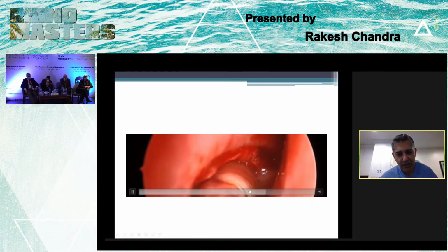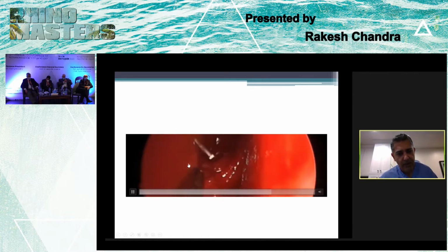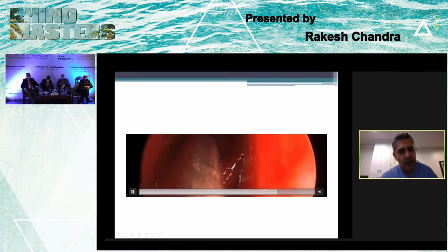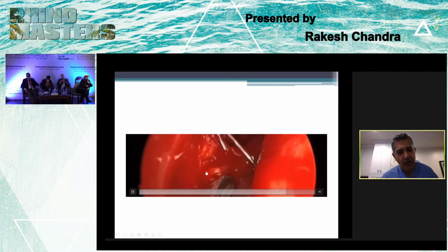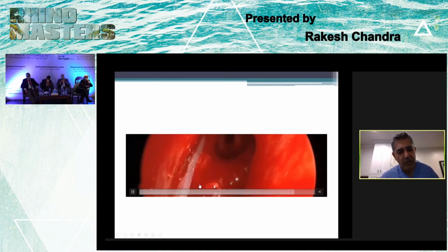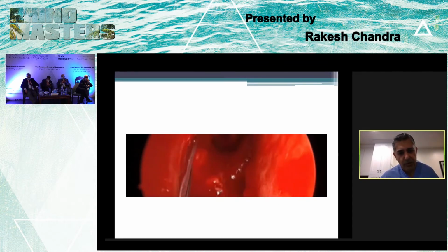It's important not to let the medial side of the drill abrade the septum in that area. Now after removing the bone, the light pipe comes through at this point. When using the light pipe, it's also important to know that you sometimes need to turn the light on your endoscope down, or else it will eclipse the light of the transillumination. Now we're passing these stents through on each side, one through the upper and lower canaliculus, and they'll be secured to themselves in the nose.